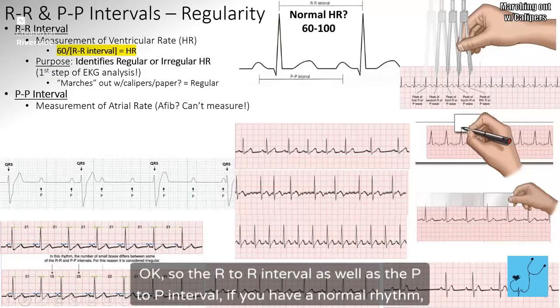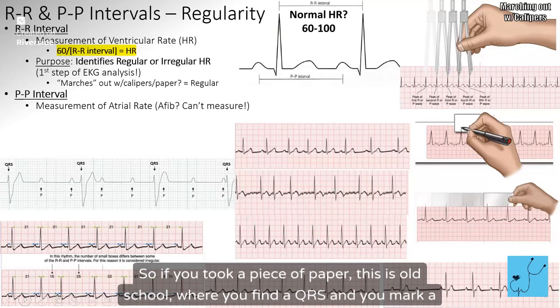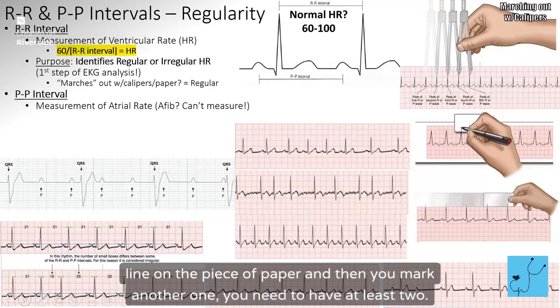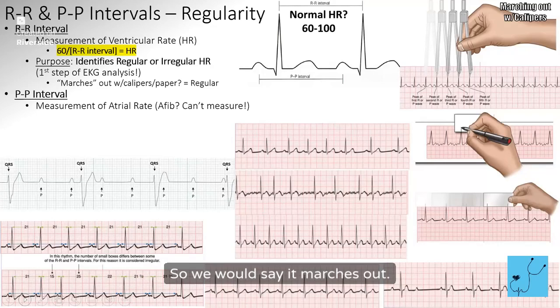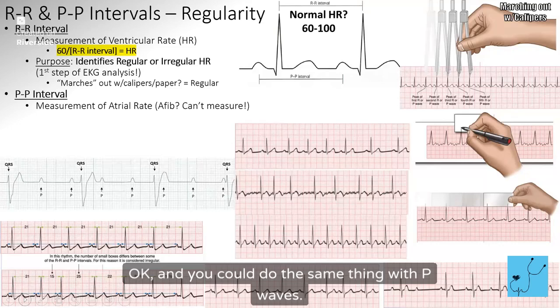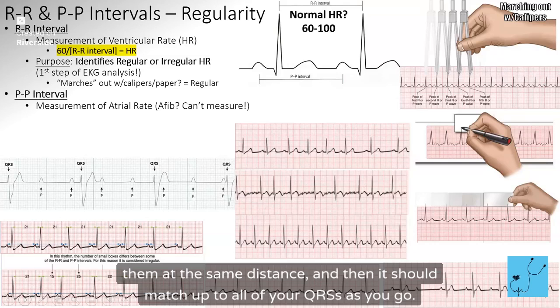Okay, so the R to R interval, as well as the P to P interval, if you have a normal rhythm, they should all march out. So if you took a piece of paper, this is old school, you find a QRS and you mark a line on the piece of paper, and then you mark another one, you need at least 2. And then you just move it along your QRSs, and they should all match up to the lines. So we would say it marches out, okay? And you could do the same thing with P waves. Or you could be fancy and take your calipers and spread the calipers apart, leave them at the same distance, and then it should match up to all of your QRSs as you go.